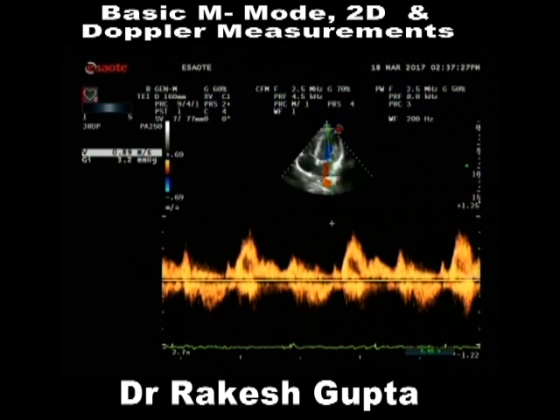So now I am measuring velocity, correct? Now if I measure a correct velocity, I should accept with a button on the right hand side. Show this button. Let's get the box again.